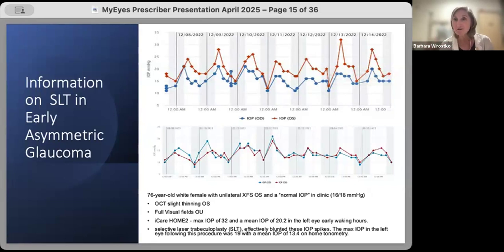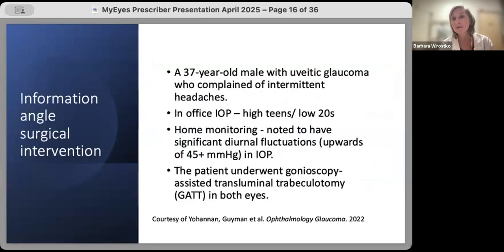So it brought it down to probably what is her normal physiologic variability. There's going to be fluctuation, but what's normal, I should say, for a patient, we don't yet know. Next slide. Hopefully I intervened early, so hopefully we're going to hold off on some damage.